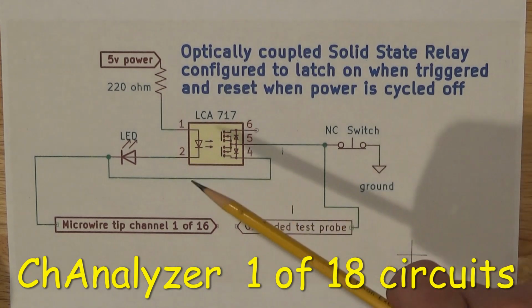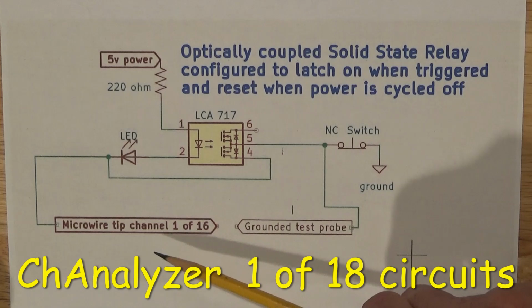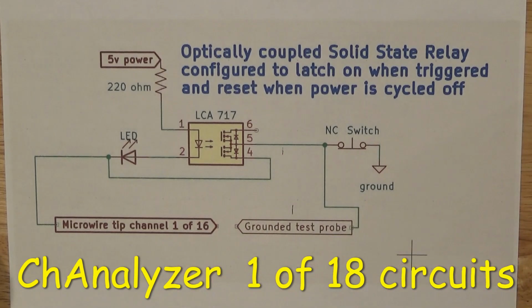Each one of these circuits would be connected through an Omnetics connector through 1 to 16 channels of the recording channels, and there's also 2 ground channels. So all of the connections will be tested with this system.